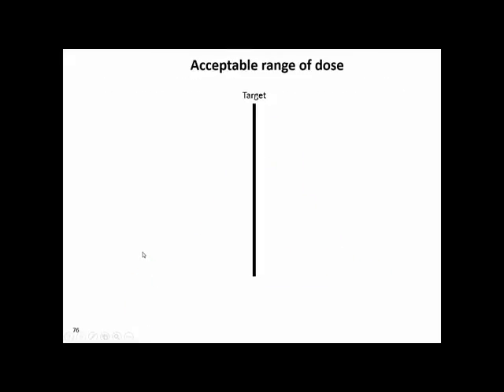If our target value is here, for example 250 for the factory preset, of course if this target value is not reached, not always we have to repeat. An example would be if the target value is like 250, but for this particular image we reached a real exposure index of, let us say, 240.